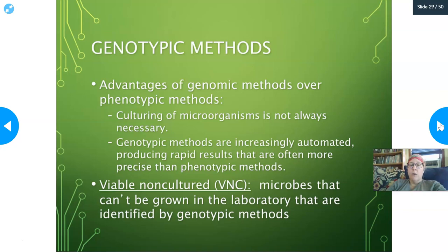Not sure if they have adapted it to include coronavirus, but I bet they're working on it. They have a whole list of all the different bacteria, all the different viruses, and even the protozoans. They can detect histoplasmosis and other things like that. So all these potential pathogens that can possibly infect the respiratory system are run in one test, and it's because it's using a genotypic method. I'll explain it to you in a little bit.